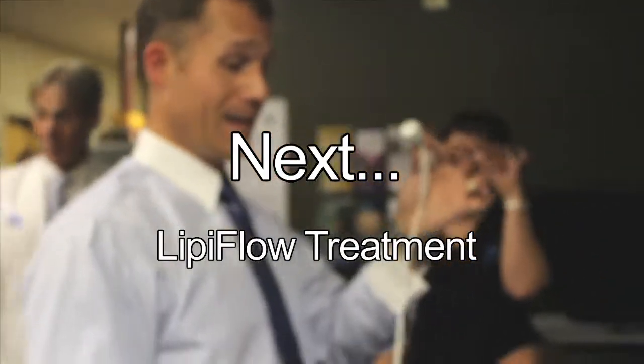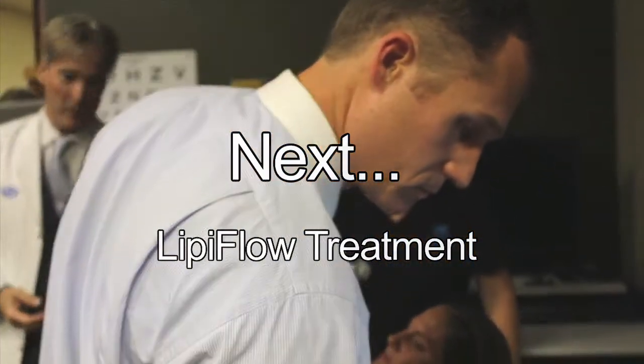And this basically, again, is just like a big contact lens. Y'all want to come watch us go in? Come over, just walk. Is it at the same time, both eyes at the same time? Yeah, typically. Usually the same. Yeah, y'all come over. Don't be shy. We're family here. Come on in there.